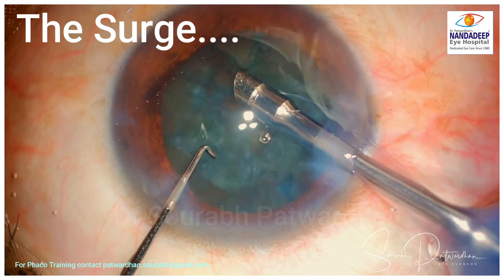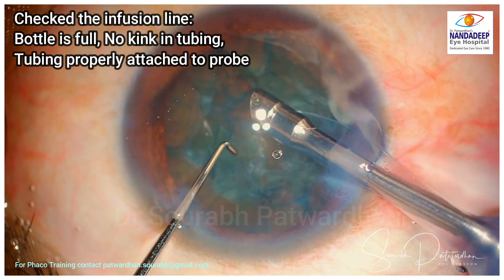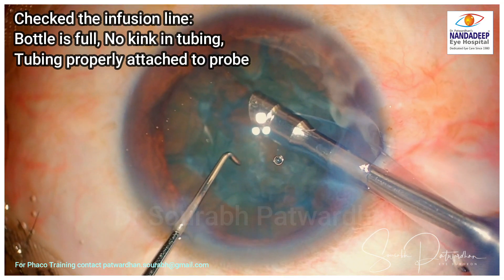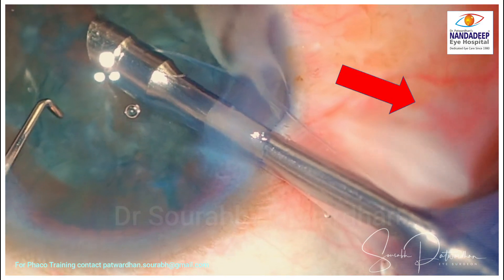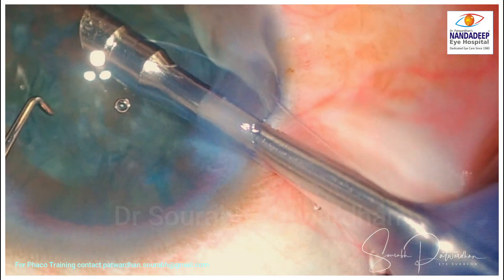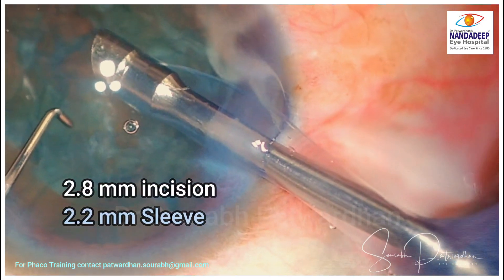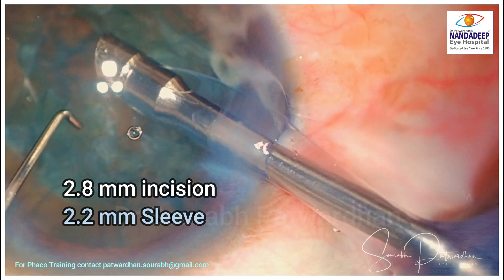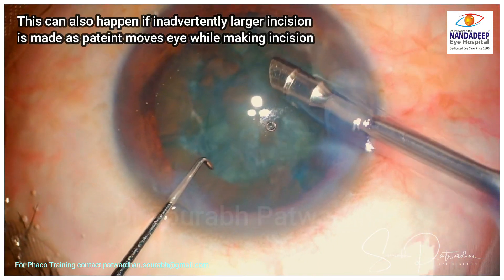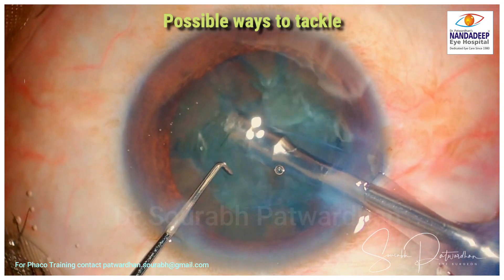The thought process is: I check the infusion line — the bottle is full, no kink in the tubing, and the tubing is properly attached to the probe, so there is no problem with the inflow. Then I notice there is significant egress of fluid through the incision. My assistant told me he gave me a 2.2 mm sleeve while I had made a 2.8 mm incision — a definite mismatch. This can also happen if an inadvertently large incision is made when the patient moves during incision making.